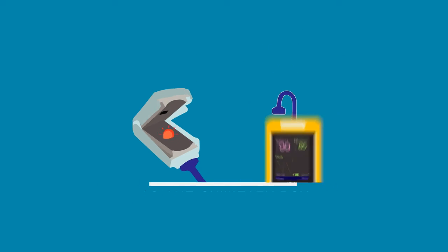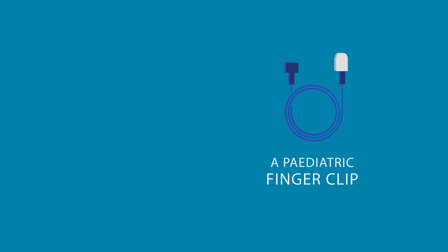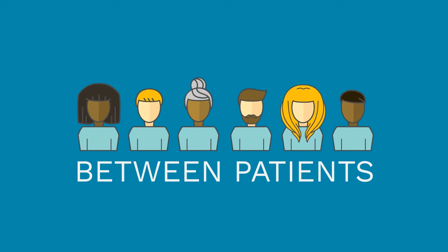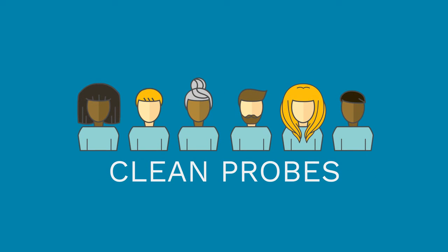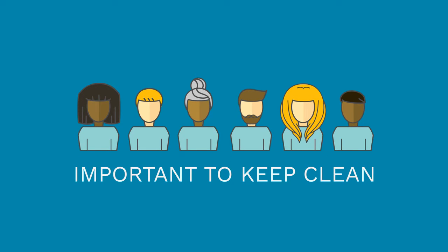The Lifebox oximeter comes with two probes, an adult finger clip, which can also be used on the toe for smaller patients, and a pediatric finger clip. Neonatal wrap probes and ear clip probes are also available through Lifebox. Between patients, you must clean the probes gently with a damp cloth or alcohol swab. It's important to keep the LED and photodetector clean.